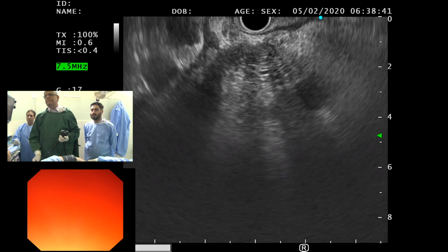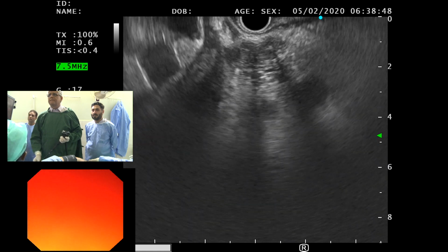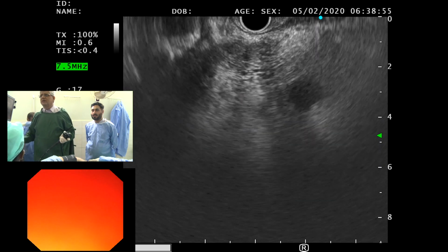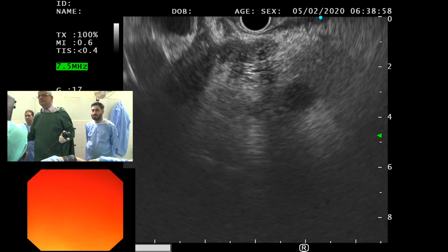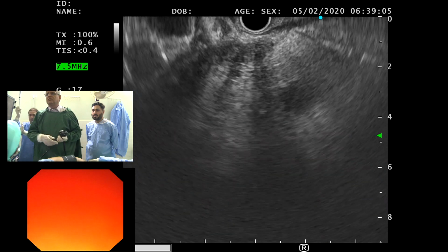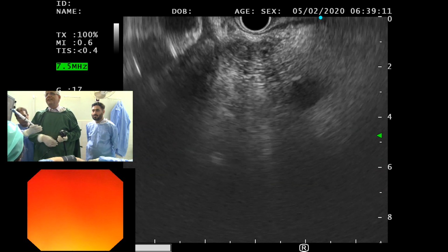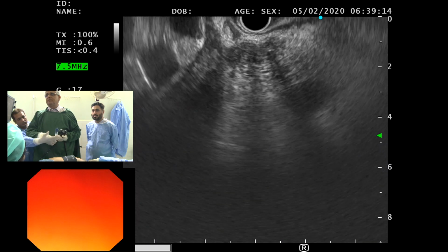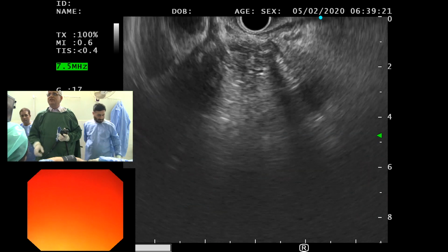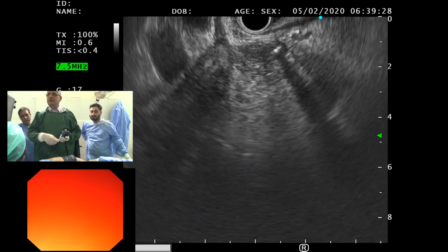Sir, one question. The distal CBD lesion is very small and there is less swelling. So how do you feel there will be a good yield of FNAC or FNB? I'm sorry, I missed your question. Okay, this is good. Sorry, go ahead. Sir, basically we are wondering because the lesion is looking very small, what will be the yield of doing FNAC? Well, we'll find out in a few minutes, but that is why I've been spending so much time trying to see exactly where I want to go and see if we can get something out of it. But it is difficult.